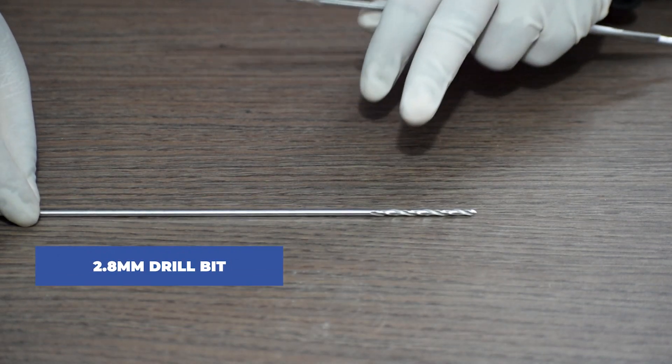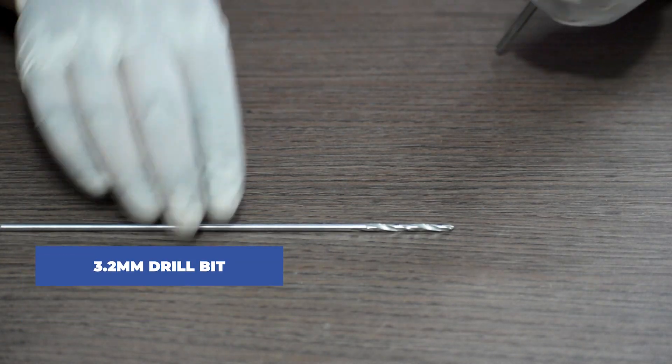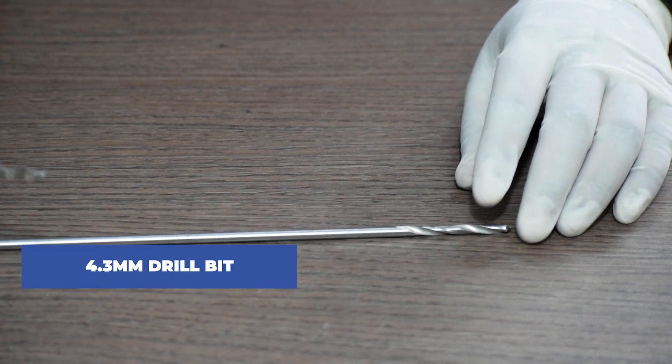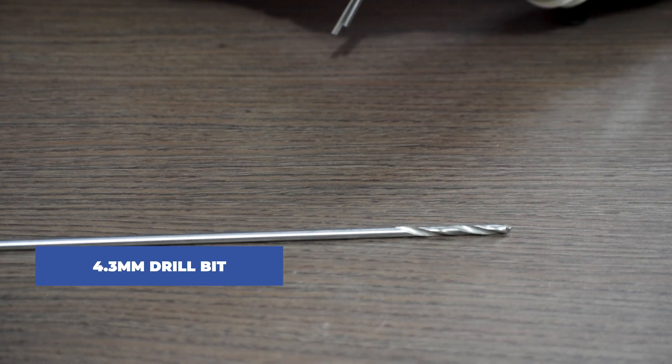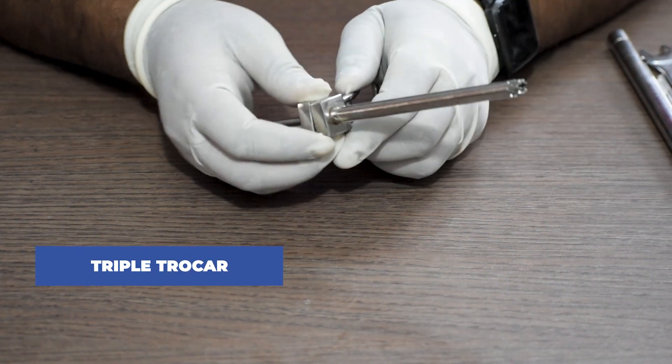Next we require drill bits. For a 3.5mm pin we require a 2.8mm drill bit, for a 4.5mm pin we require a 3.2mm drill bit, and for a 6.5mm cancellous screw we require a 4.3mm drill bit. Lastly, this is a triple trocar.